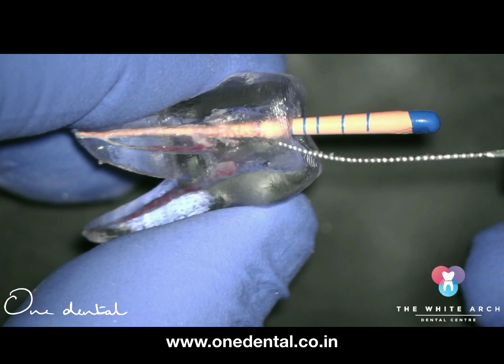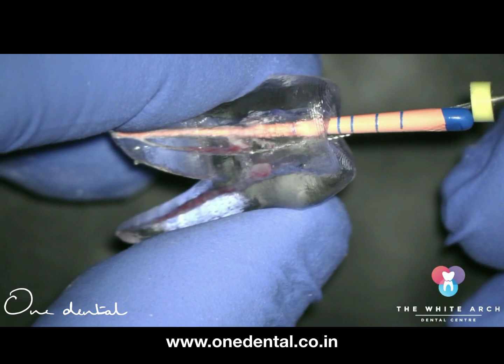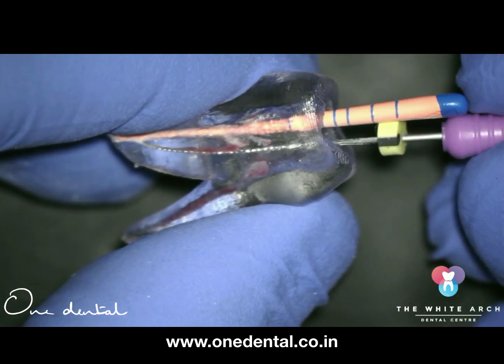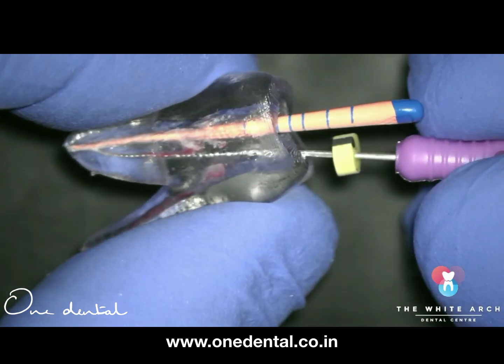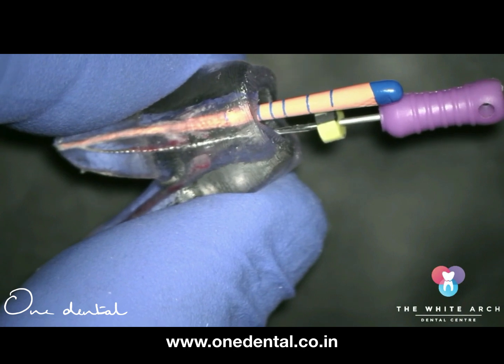There are many tricks in treating joining canals. One simple trick is to prepare the main canal first to the prescribed diameter. Then, for the second canal, introduce a small file — like a number 10 file — and do some watch-winding until it gets some resistance. Sometimes when it touches the master cone, the master cone starts moving.